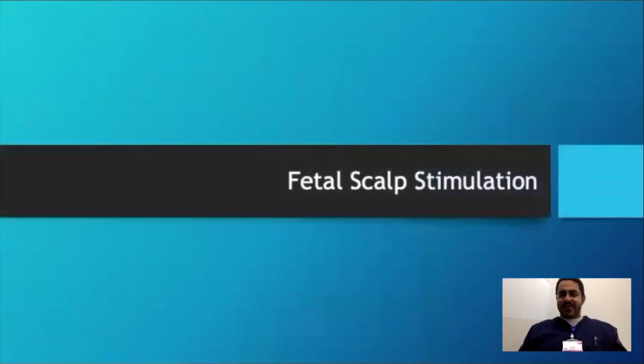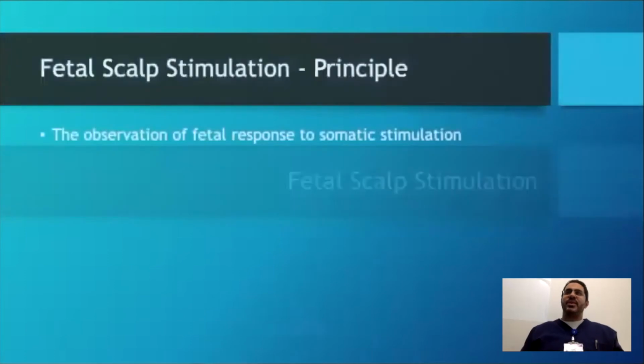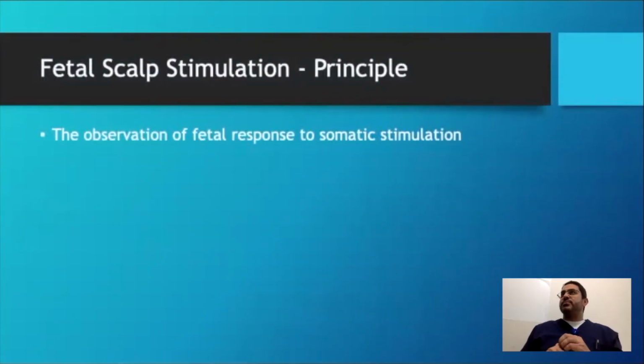Okay. So, running really quickly through fetal scalp stimulation. We talk about it all the time. When is it helpful? What is the idea behind fetal scalp stimulation? We assess three parts of the baby's CNS, the baby's brain: autonomic, so sympathetic and parasympathetic, and the somatic. The one that protects and responds in labor and in all sorts is usually the autonomic.